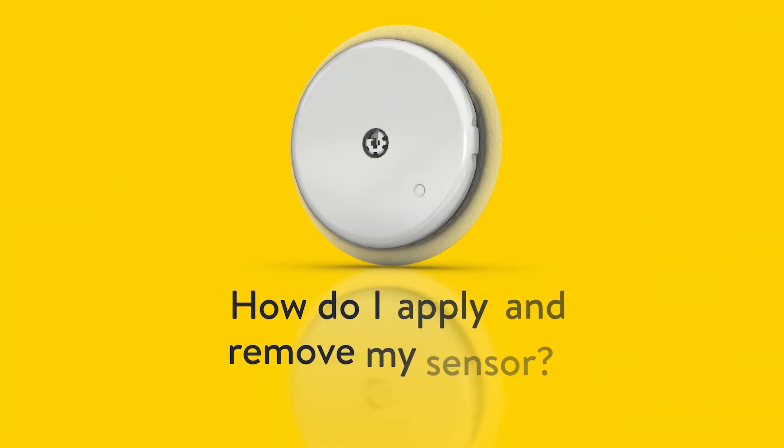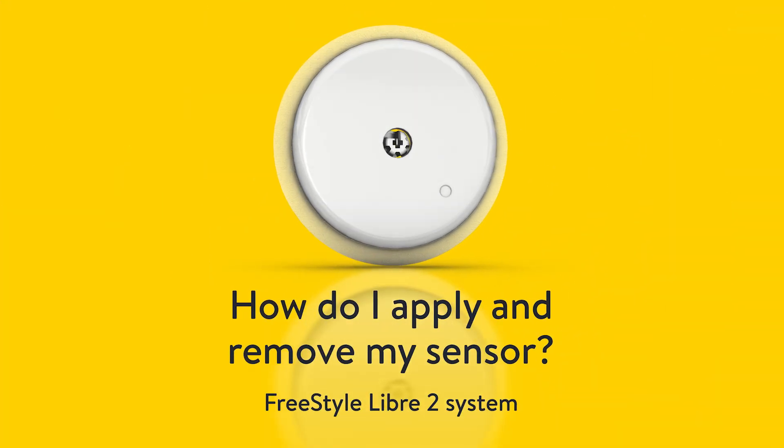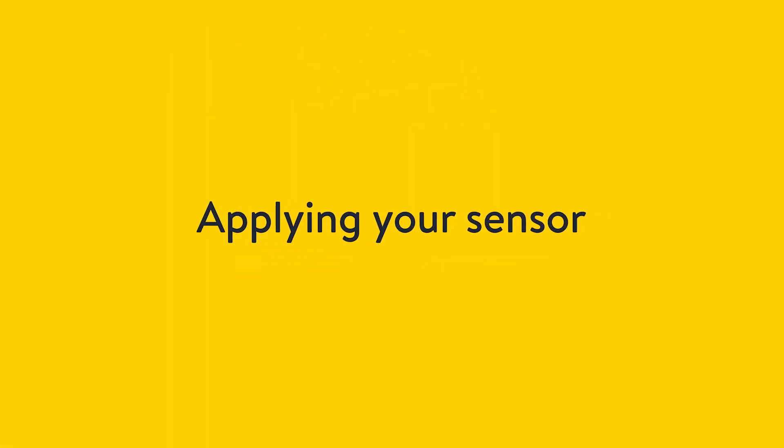In this video, we'll show you how to apply and remove your Freestyle Libre 2 Plus sensor. Let's start with applying your sensor.